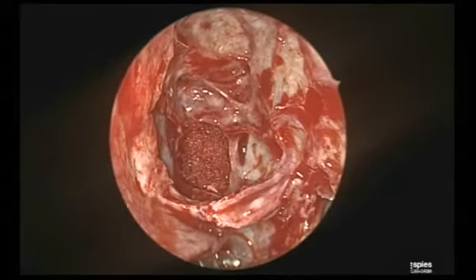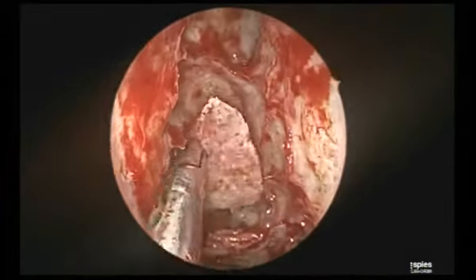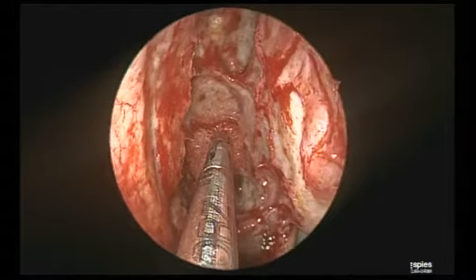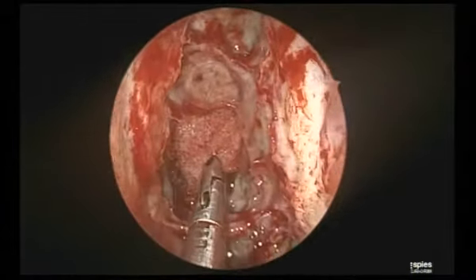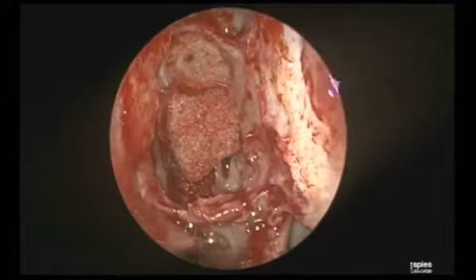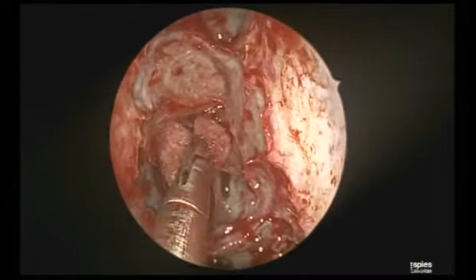Now, as Deepak asked, the posterior ethmoidal. The most reliable landmark for the post-ethmoid is not the anterior ethmoidal artery. You can't calculate that the post-ethmoid is 12 millimeters behind the anterior ethmoid. It cannot work like that. Sometimes the anterior ethmoidal artery is pushed behind, and sometimes there is a middle ethmoidal artery; I have observed it many a time.